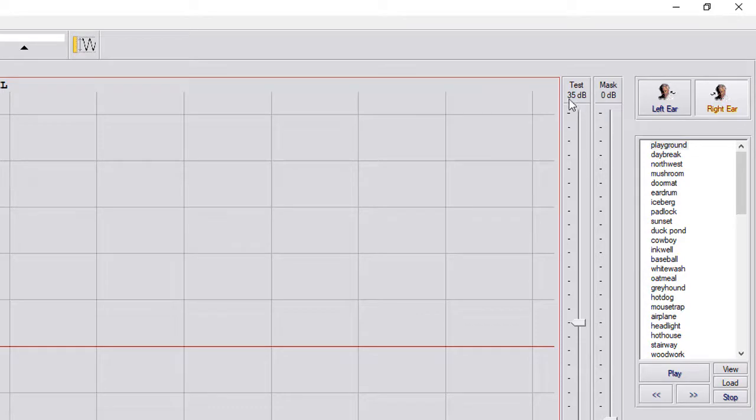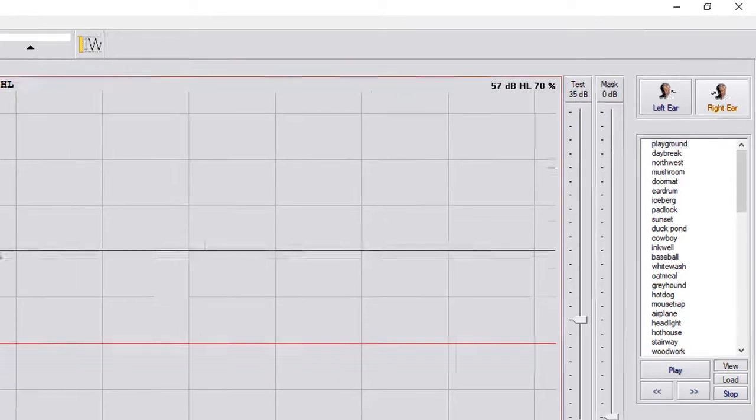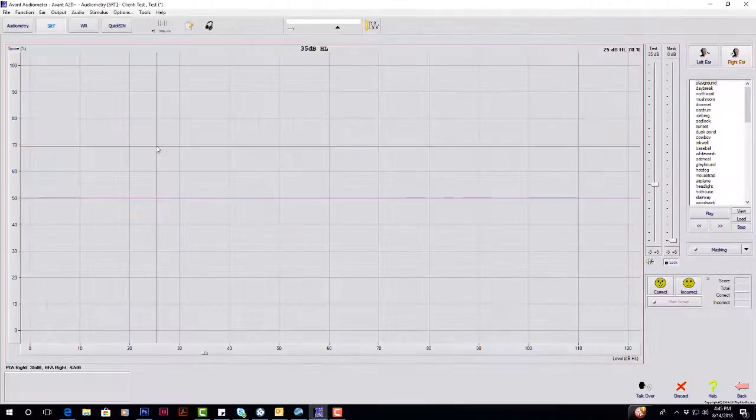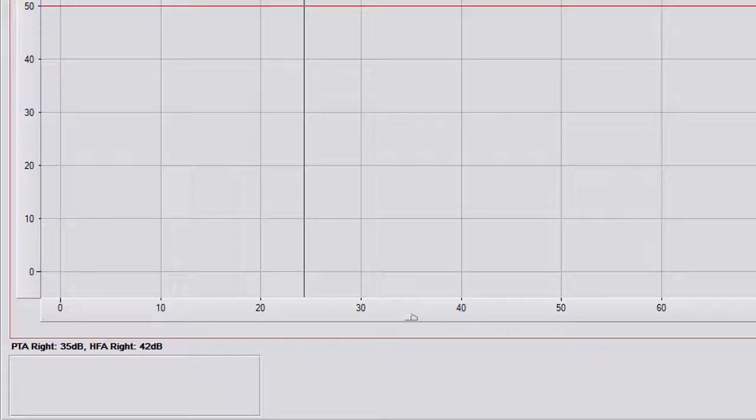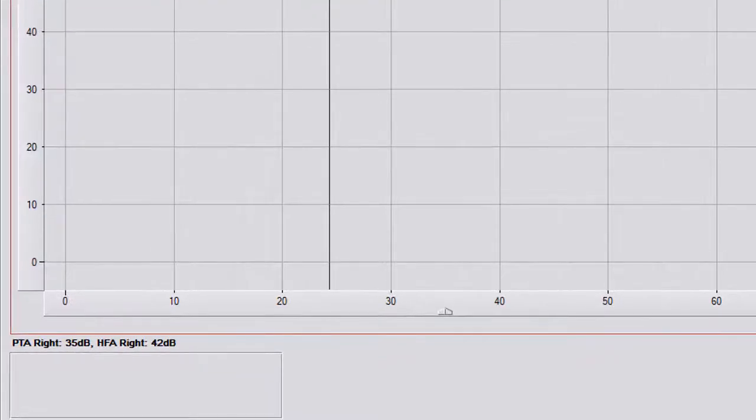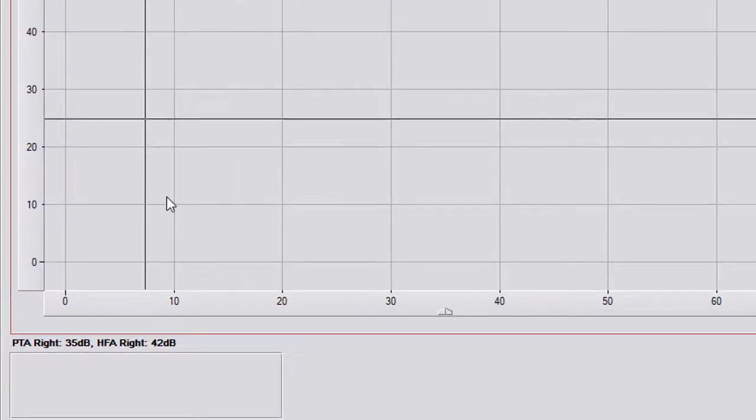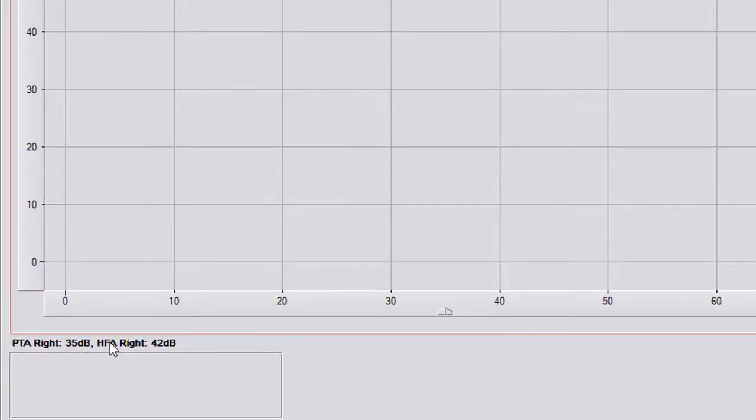Your SRT start level right now is at 35, and that is because the SRT option is set to PTA. And in the bottom left hand side, it says PTA right is 35 dB.